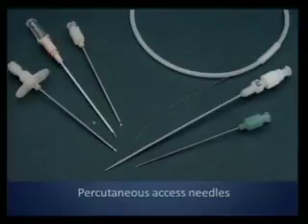This is a vascular cath. This is actually a 5 French catheter or a needle. You just slide it in. This is the kind of Seldinger needle that we use these days, the hollow needle. This is a micropuncture. This is a 21 gauge micropuncture. This is a 018 wire. I'll tell you the sizes in a little while.